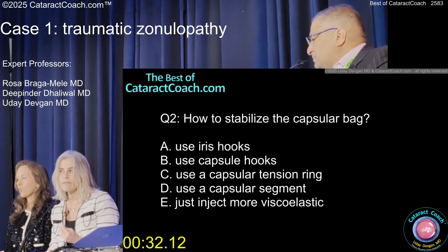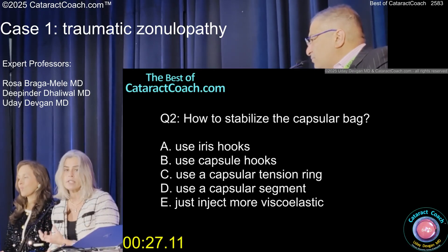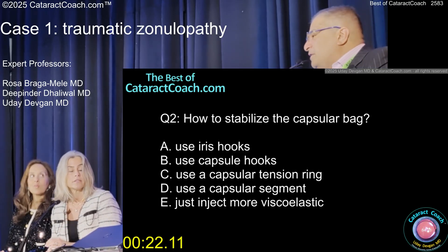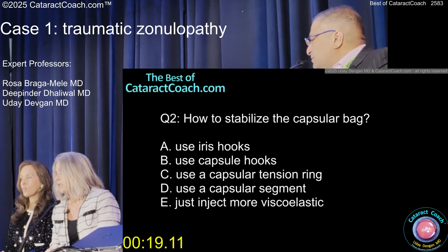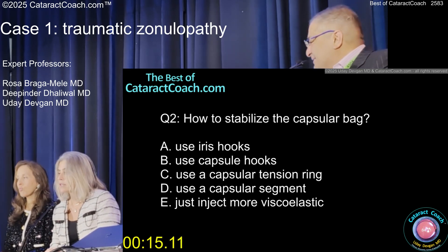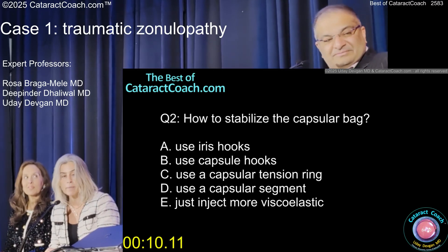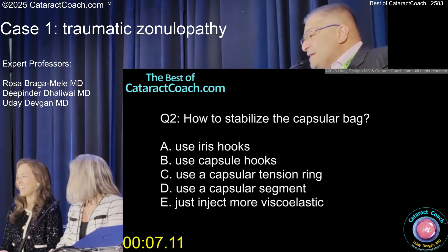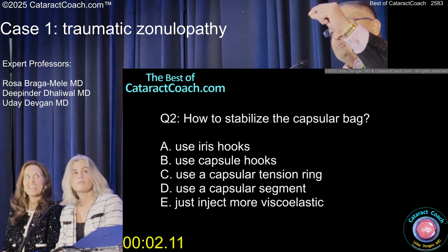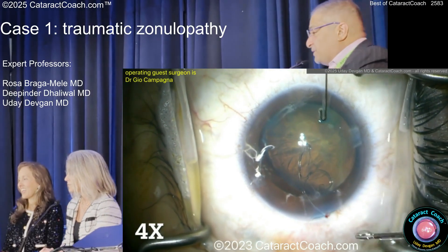If you don't have capsule hooks, I would put an iris hook to hold the capsule — but you have to be very careful with iris hooks that you don't grab your capsule edge and tear it. How many hooks do you think you'll need in this case? They are seeing this case for the first time — two at least. Might be more, you might be surprised — might be ten. I saw a neat technique from one of Neto's associates where he puts in the hooks at the beginning, just preplaces them, leaving just the tip of the paracentesis.